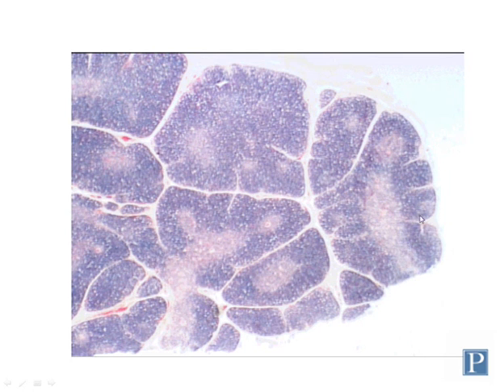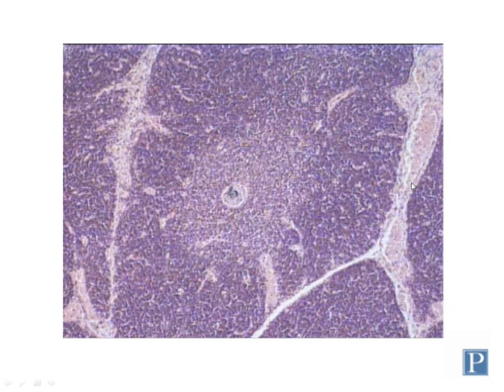You can easily recognize the thymus based on its lobulated structure, meaning that the stroma is divided into small cordoned off sections called lobules that you can see here, that are separated by connective tissue in between. You can also identify it because of the dark staining, more basophilic cortex, and lighter staining medulla, which is deeper in the tissue. And the cortex, although basophilic, is not composed of nodules. There are no nodules to be seen here.